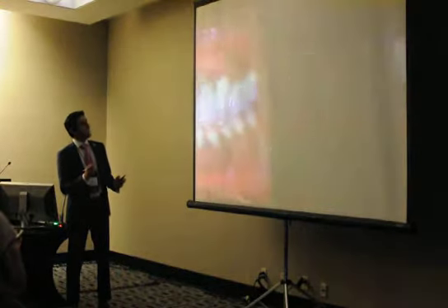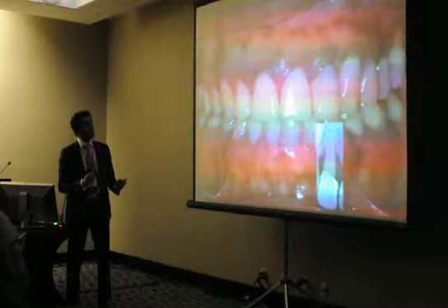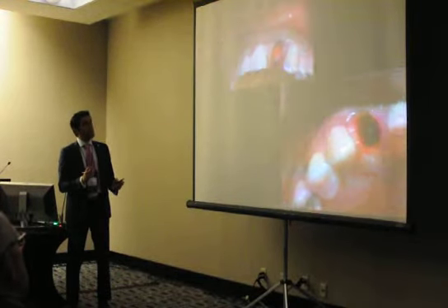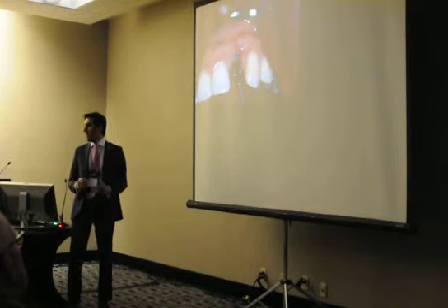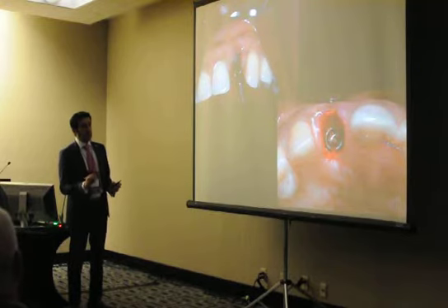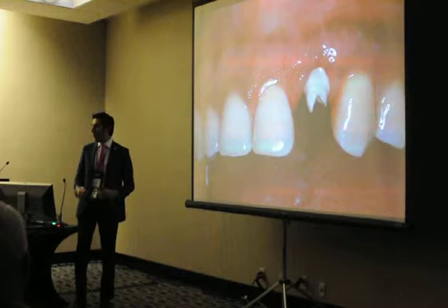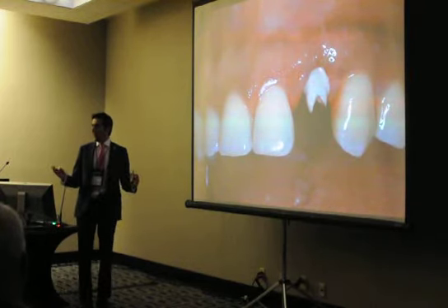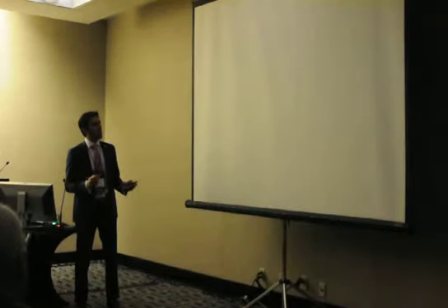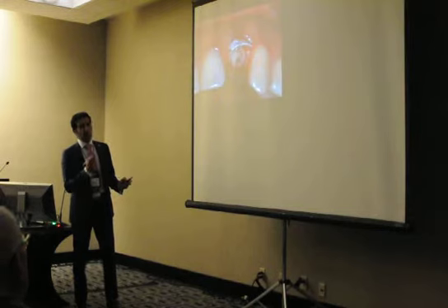Now let's look at this case — a lady who's going to have a tooth removed with some periapical pathology and a lot of mobility. We still can do this: take the tooth out, clean the area — you'll see a little deficiency here. The implant goes in, nicely torqued. Anything above 45 Ncm gets immediately loaded. We look at the implant and the gap — no flap. You can see how nicely the extraction is done. We also try to make custom abutments ahead of time so there are minimal removals and insertions — this is a one-time deal.